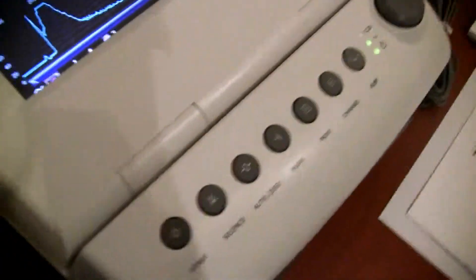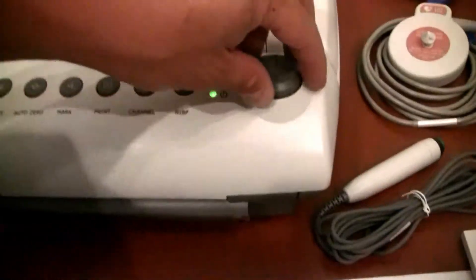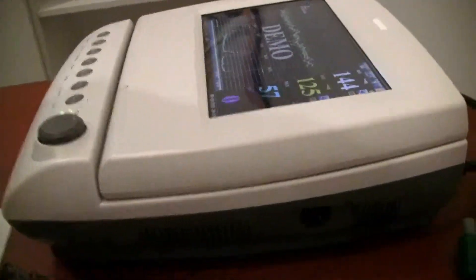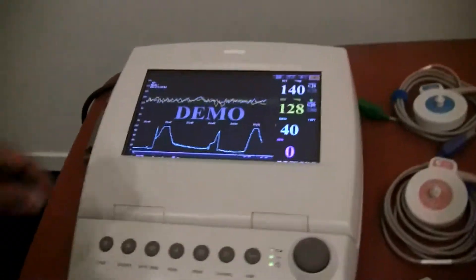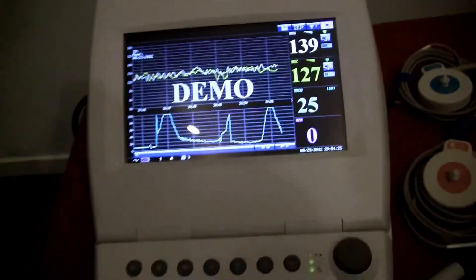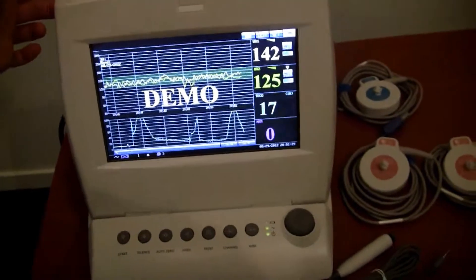There are functionality keys across the front that we'll go into in more detail in a moment, including most importantly your trim knob. The power is on this side. The screen is foldable and adjustable — simply slide the button, and it has several levels that you can adjust it to.